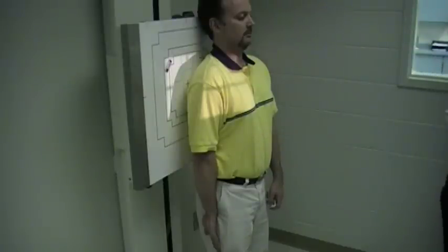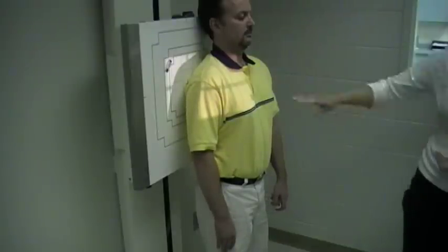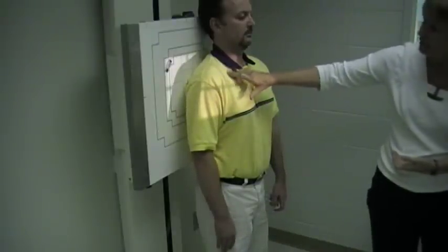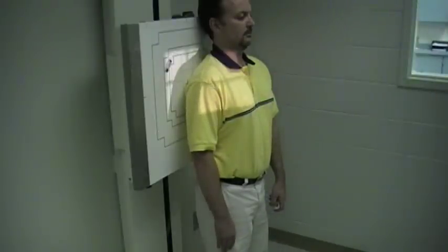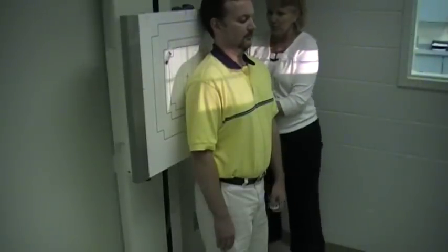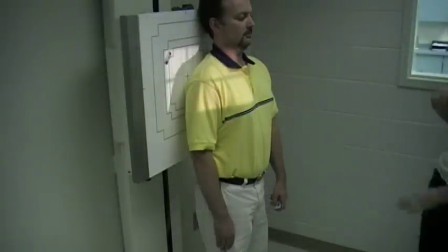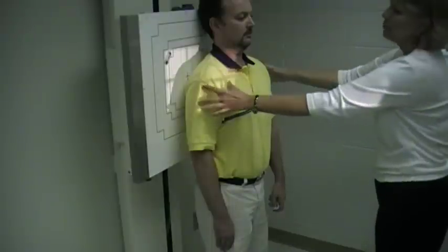Alright, next is the AP projection for the clavicle. So with the clavicle, you want to be centered right at the level of the clavicle. So I'm just going to move our central ray up just a little bit higher. Whenever you move your central ray, you want to adjust your bucky accordingly. And then you want to have the central ray at mid-clavicle.